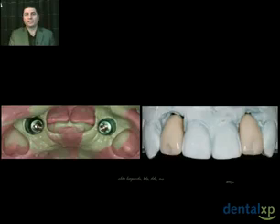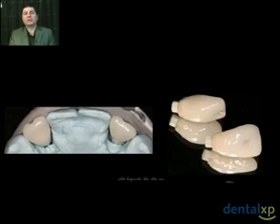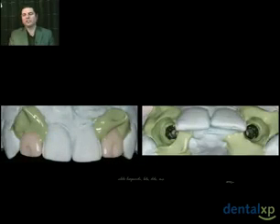The whole purpose of taking implant level impressions is for me to be able to generate for her customized provisional restorations. The slide on the right shows you screw-retained provisional restorations, and these have been fabricated utilizing provisional components from the manufacturer. You notice they're screw-retained. You'll also notice that the access chamber is toward the facial. The access chamber is going to be sealed with composite resin, so it's not a problem.